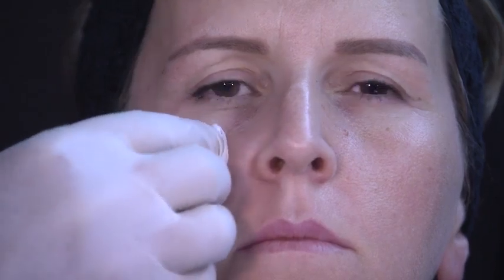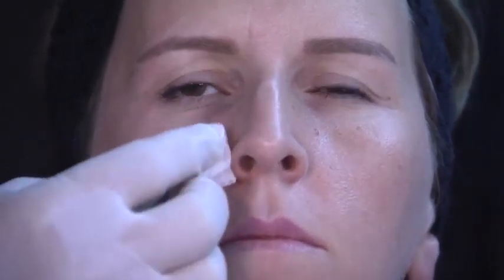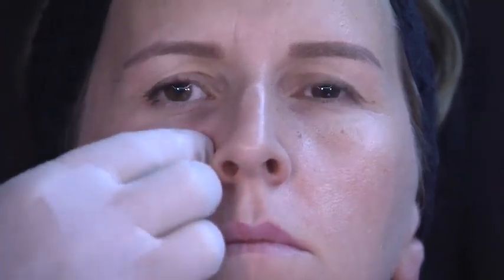Now I am going to mold towards the medial part of the tear trough. This is a product that is very easy to mold, so I am avoiding risks. This is the first patient, especially for the beginners that want to start treating the tear trough.